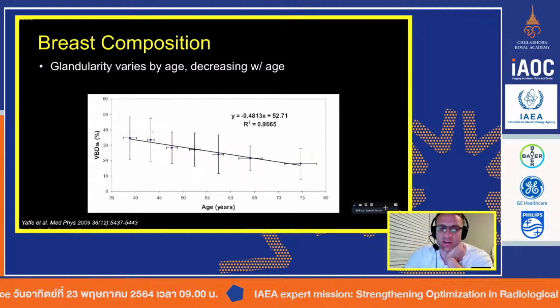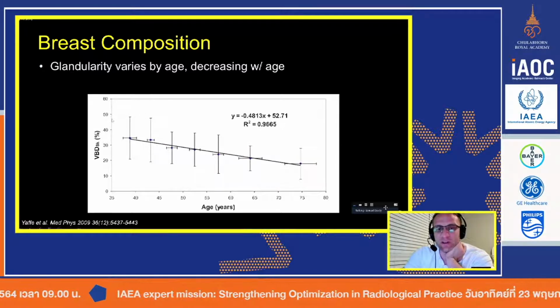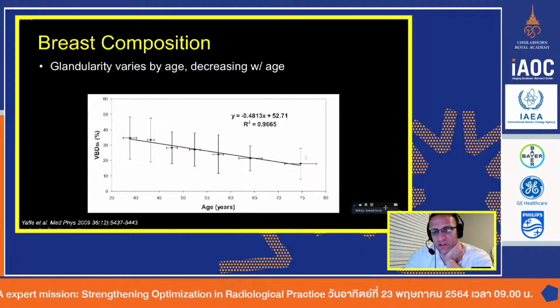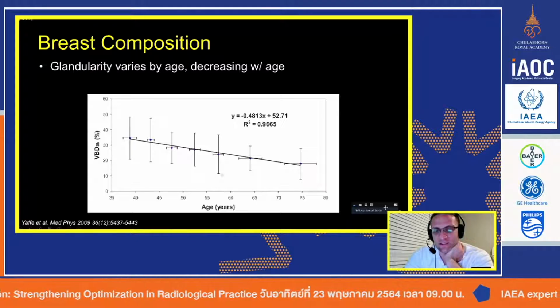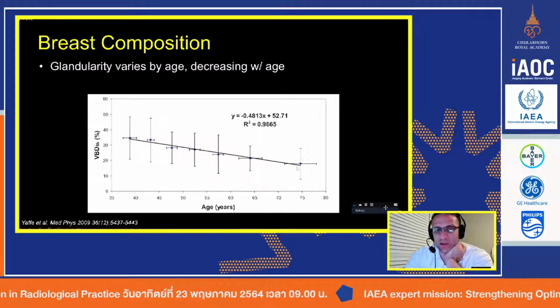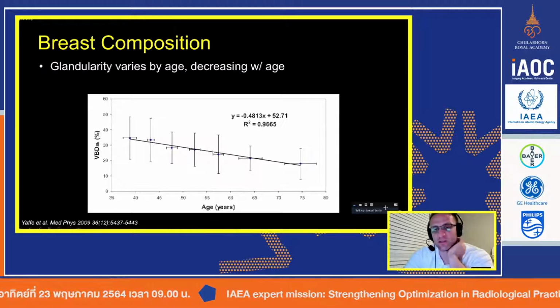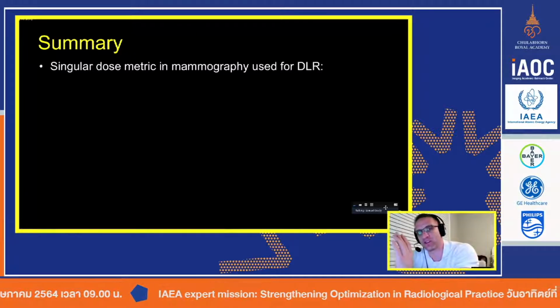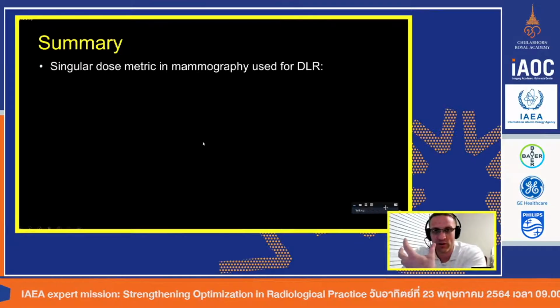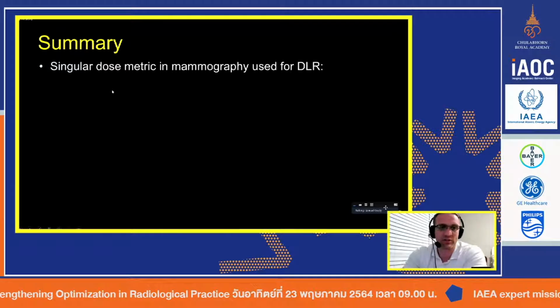So there is a certain population in the younger era that could be your 50-50, but as you trend older, especially out towards 70 and 80, this is where that mean is shifted so low to 19%, because the majority of women getting mammograms are over 40, and that population is starting to skew more fatty, or more fat per volume of the breast than glandular tissue.